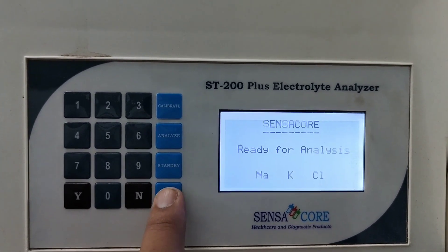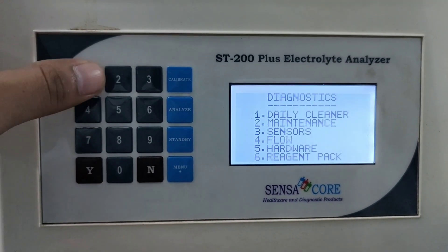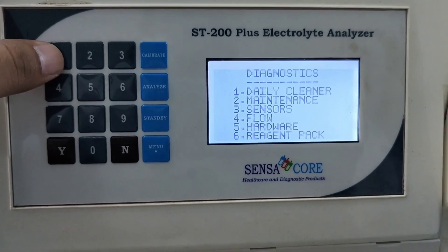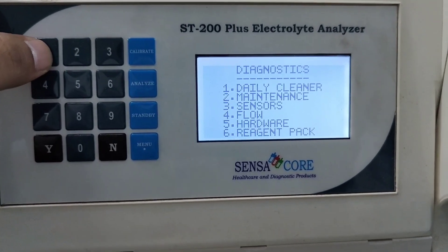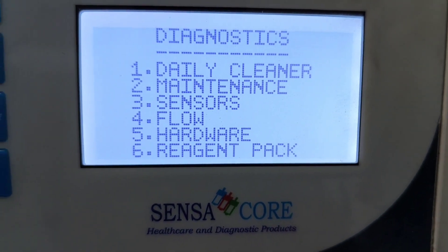Let's have a look at the menu. One for diagnostics, one for daily cleaner, two for maintenance, three for sensor, four for flow, five for hardware, six for reagent pack.